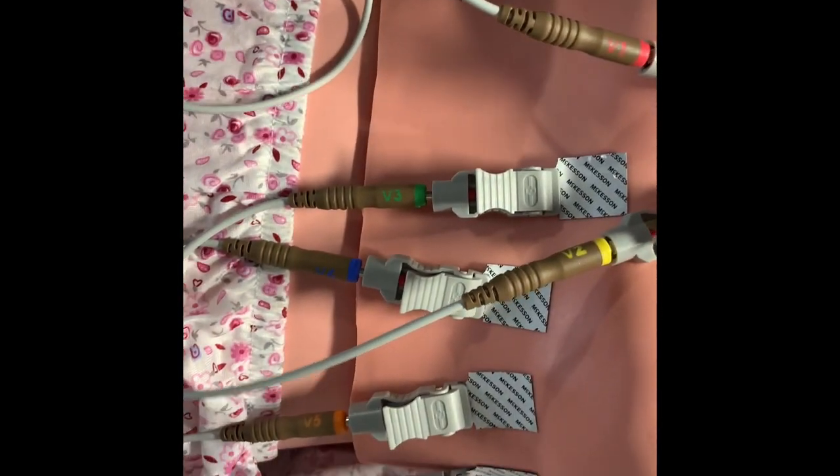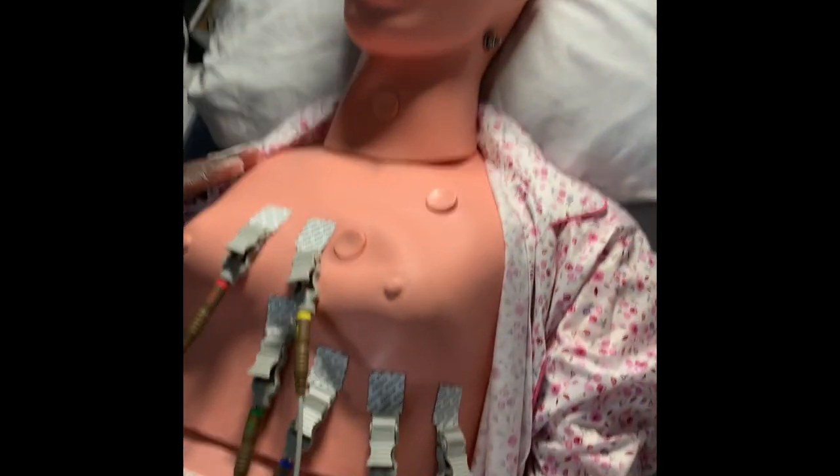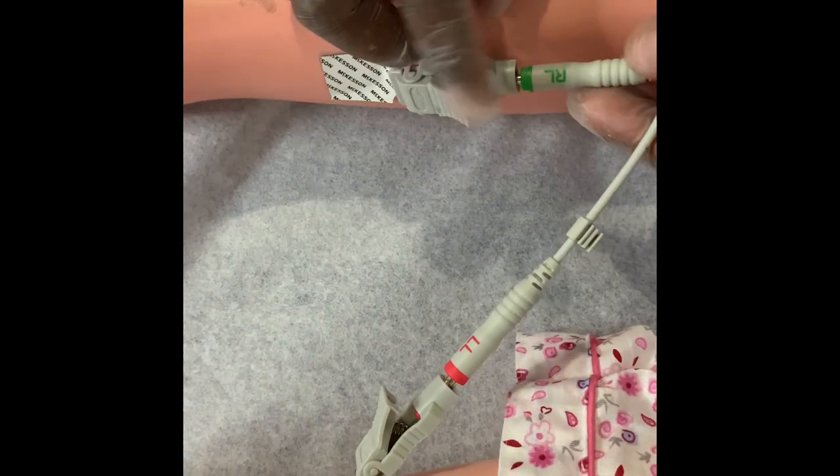I'm going to go ahead and cover the patient up a little bit. You want to make sure the leads are on the patient, and the reason I'm putting the blanket back is so the patient isn't cold — so I can get a nice EKG. Just remember: V1, V2, V3, V4, V5, V6. Right here it says RA — right arm — and left arm. Right here it says LL, and right here it says right leg.